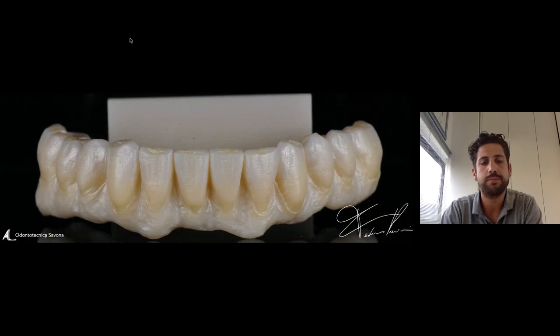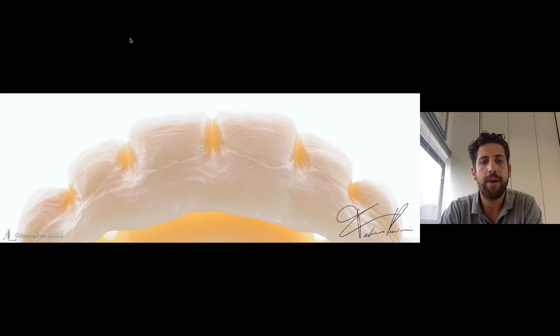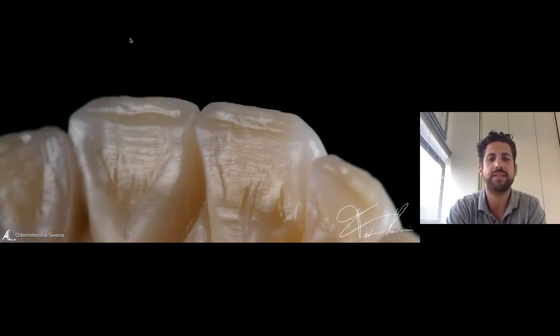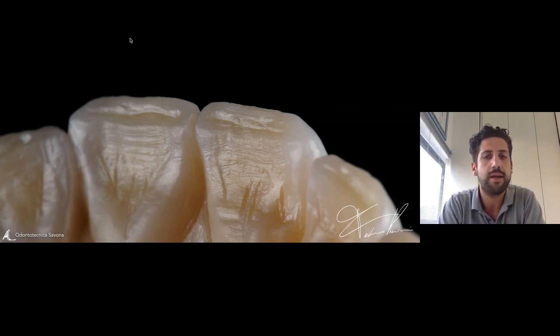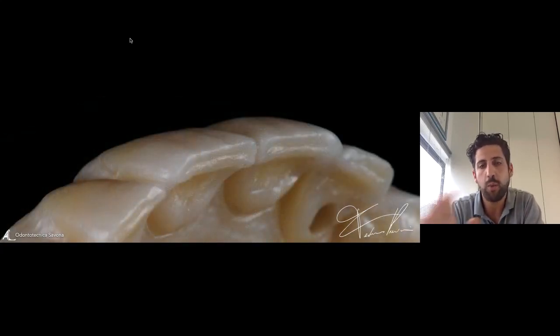Lower jaw. Some details of our structures. Compare with the light to see our texture. And also I like to make some pictures of the palatal side. This is a really important side, and I really like to take some pictures of that. Incisal edge with the abrasion, and we will also make characterization in the abrasion with some orange, some brown.